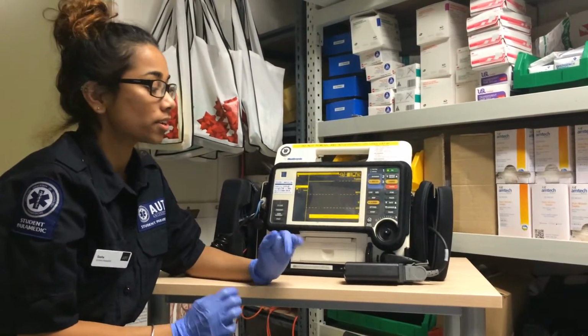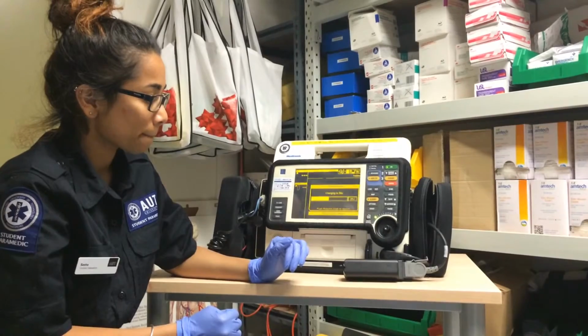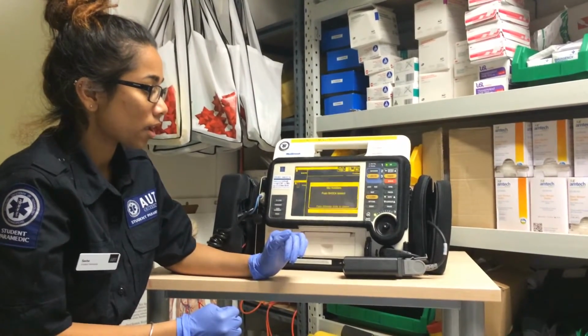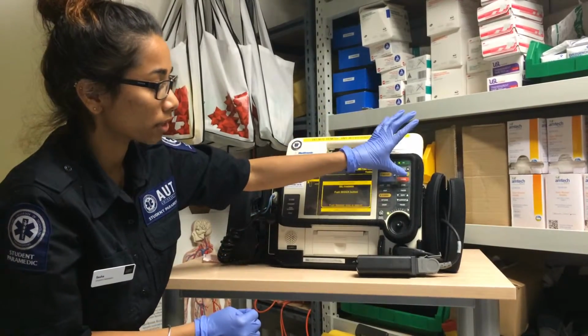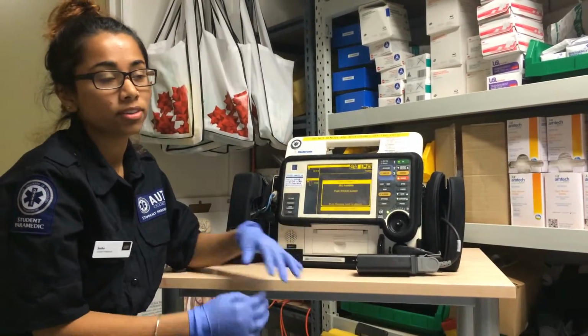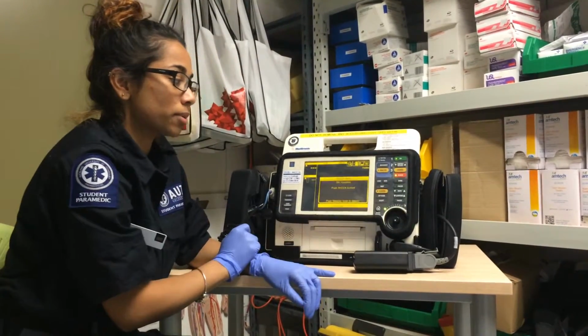And we also then want to charge the machine. So you would click the orange charge button, and once the charge is ready to be administered, you want to then click the red shock button, and it will administer the shock. So everyone stand clear, and the shock will be administered.